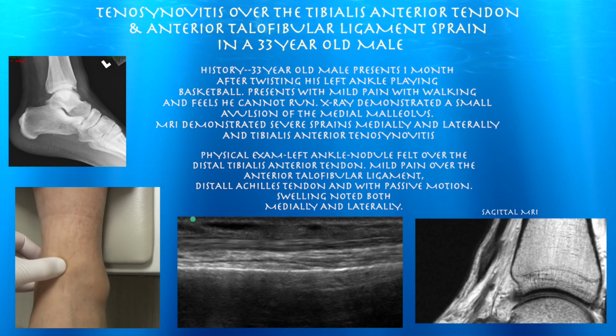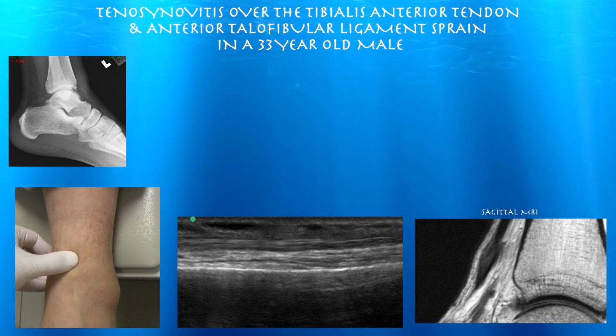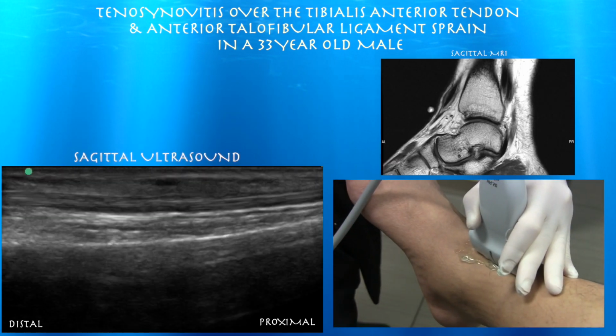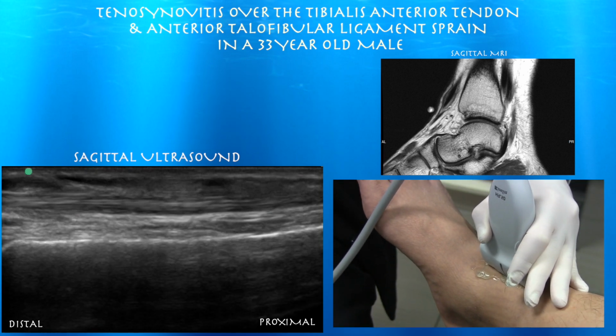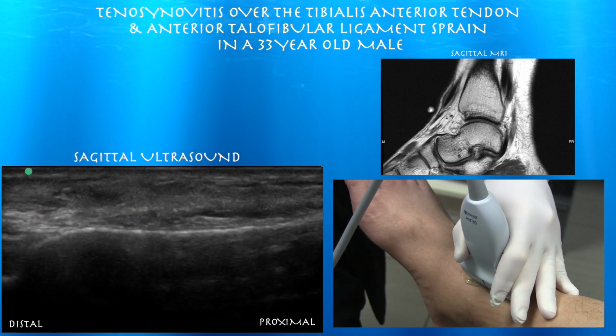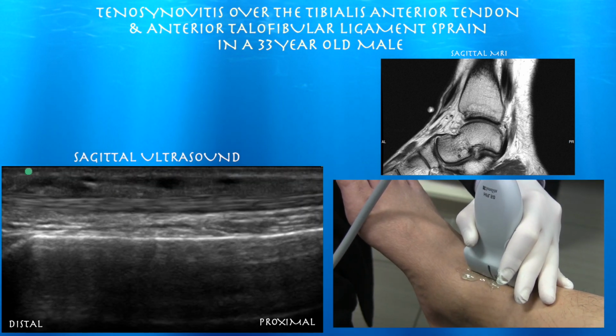Seems like it's basically maybe coming off the tibialis anterior tendon. The left side of the screen is distal. We're just looking at it as, here's his tibia. And we can get the tibialis anterior tendon. And here is that fluid again.